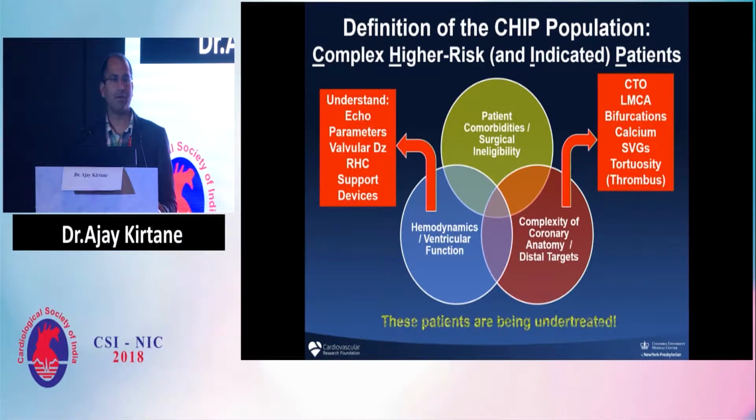Ramesh showed you this slide. I'm not going to go through it in detail other than to say that we define who these patients are. There are a variety of ways, and it doesn't mean that you're a CHIP patient if you have one of these. The other thing that's important is CHIP is not about a particular device either. It's not just, oh, I used an Impella, therefore it's a CHIP case.